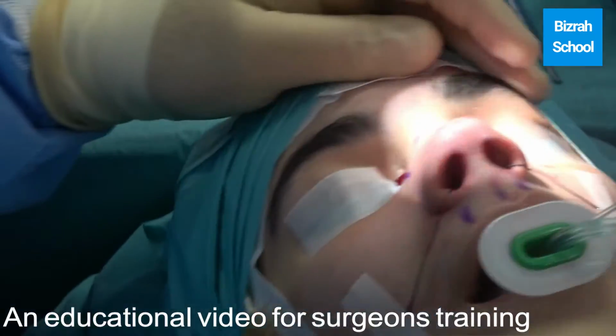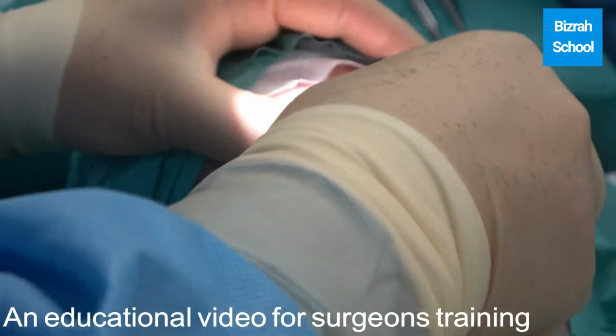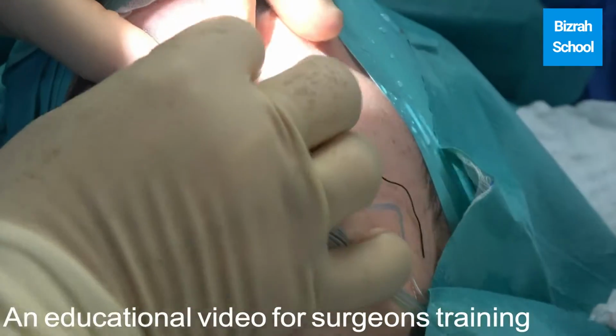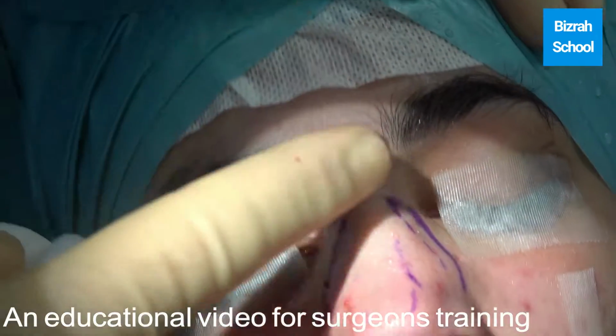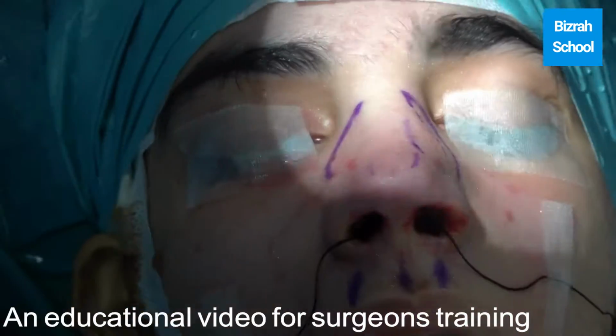Okay, you see the patient tolerating the procedure very nicely. And now trying to mobilize. See, maybe you heard the tick. You see now the nose is absolutely straight. Look, now the nose is absolutely very straight. It was grossly deviated to the right, now it's almost very straight and symmetrical.